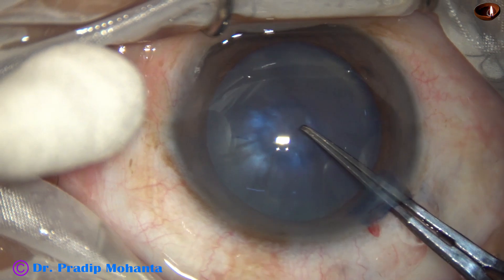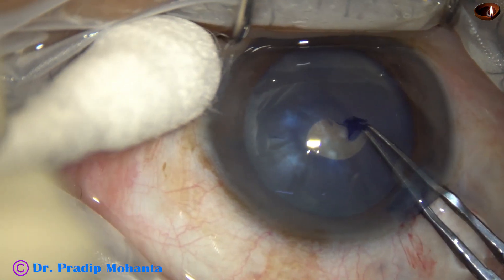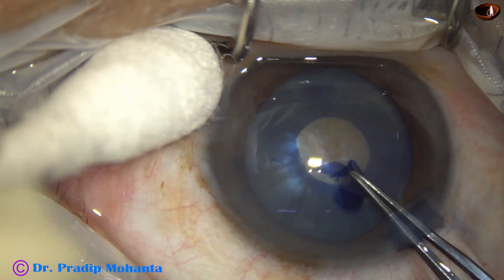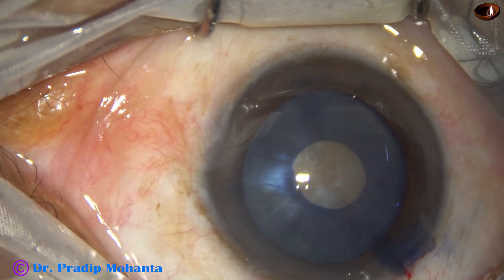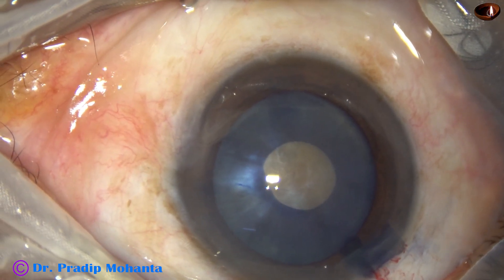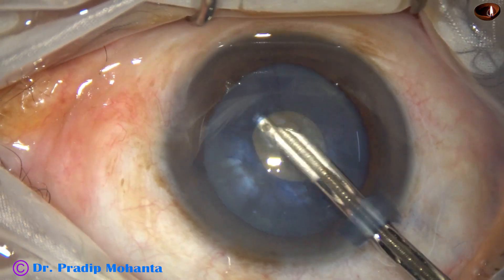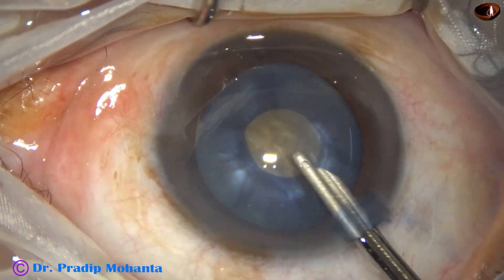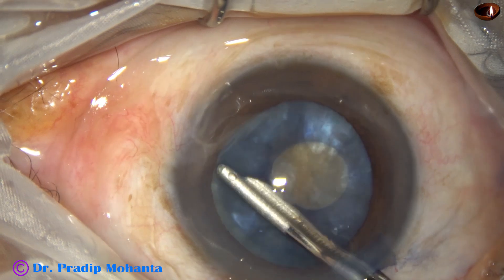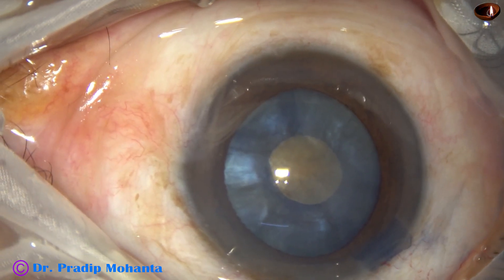I'm using a Utrata forceps to puncture the anterior capsule at the center and do a small rhexis. Watch that — nothing came out. The intralenticular pressure appears normal but is not. There is convexity of the anterior surface of the lens and we have to make it flat, so I'm aspirating and squeezing out some cortex to make it flat.